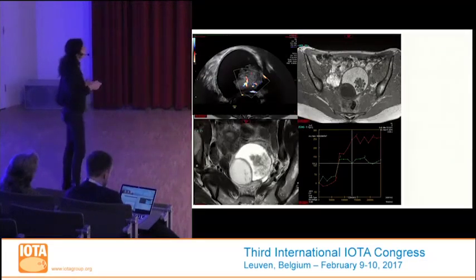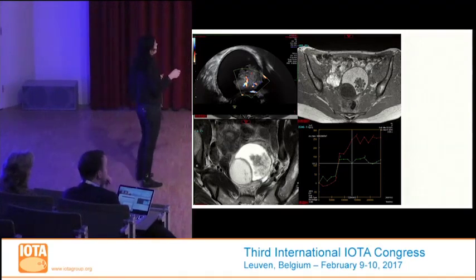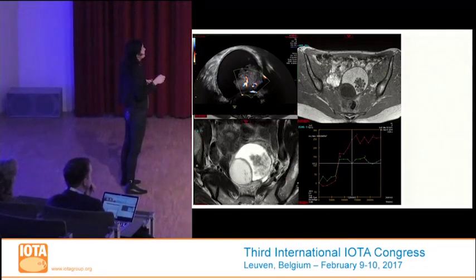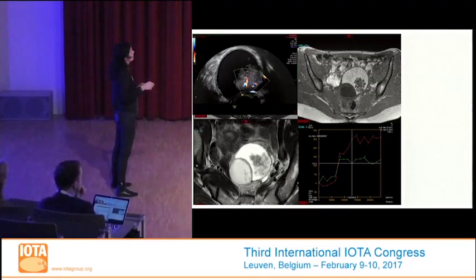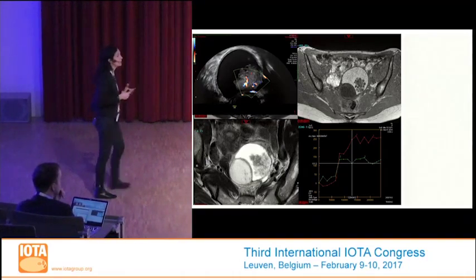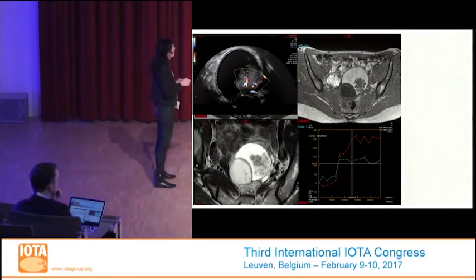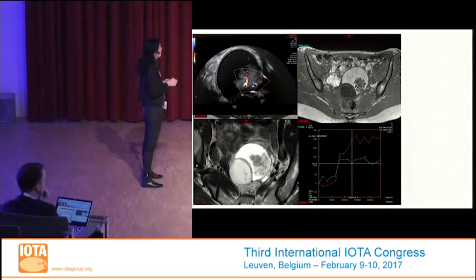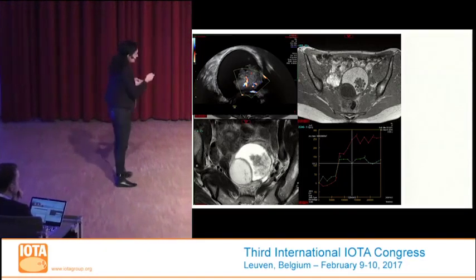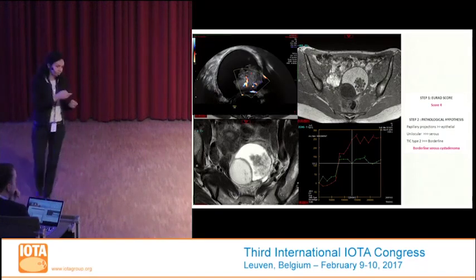And when we look at the morphology, I think it's very interesting using MRI. Here you have the ultrasonographic features, and look at that. It's completely different. You can easily recognize the papillary projection according to the pathological definition, and also you can recognize there the vascularizing tree we have in borderline lesion, and this lesion was a borderline serous cystadenoma.